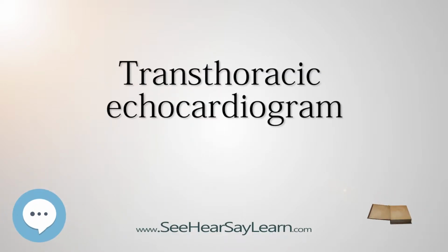A transthoracic echocardiogram, TTE, is the most common type of echocardiogram, which is a still or moving image of the internal parts of the heart using ultrasound. In this case, the probe, or ultrasonic transducer, is placed on the chest or abdomen of the subject to get various views of the heart.